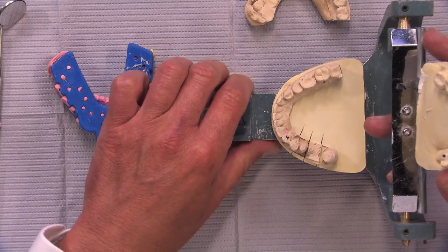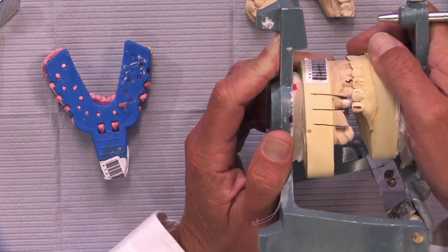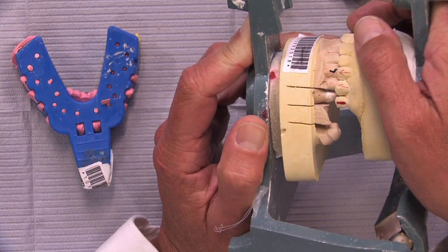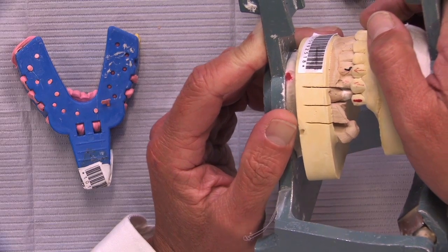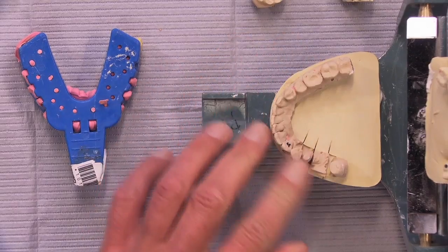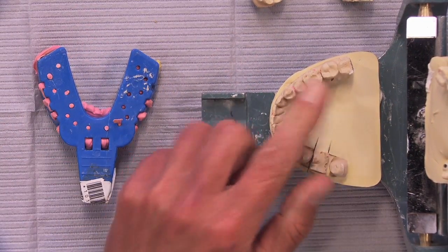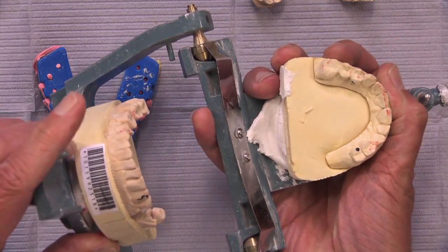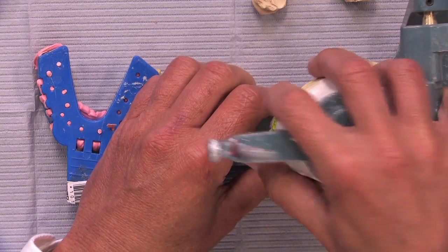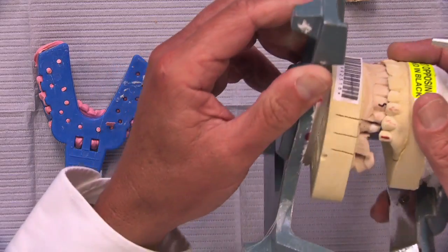And one of the first things that our technicians noticed when they put the case together was that there was not quite enough room between number 20 and the opposing tooth. Because this is a CAD/CAM product, well, actually nearly all of our products now, we take this model and we scan it. Since this did not come in as a digital impression, it came as a polyvinyl impression, we pour it and then we scan it, and then we scan the opposing, and then we scan the bite of the two together, and then the software tells us how much room we have. In this case, we didn't have enough room according to the software, and it was verified when we looked at it visually.